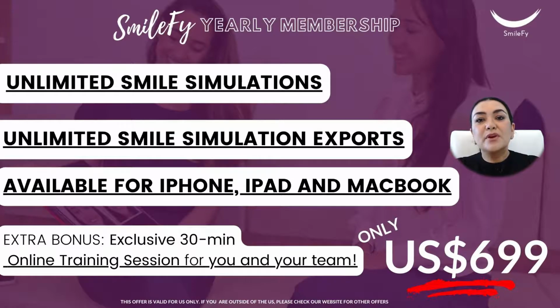One of the things that we are giving to you, and I truly believe that will benefit not only you, but also the whole team, is that we have a virtual training that we provide when we onboard the whole team. You can bring assistants, you can bring hygienists, you can bring your treatment coordinator, or you can bring your associates, and they will learn how to take the proper picture and how to get started. So we do something very personalized to you and to your whole team.